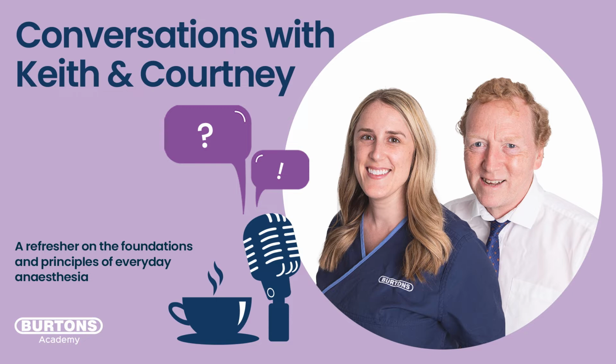So if we are now monitoring capnography in our anaesthetized patients, why should we be doing this? We know that we want to keep the blood pH nice and normal, but why really in our anaesthetized patients? What makes it normal and abnormal? What gives us this hyper and hypocapnia in anesthesia? Why should we really monitor capnography?